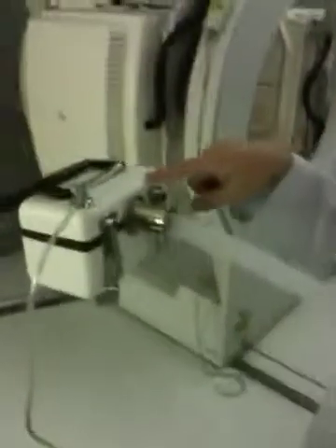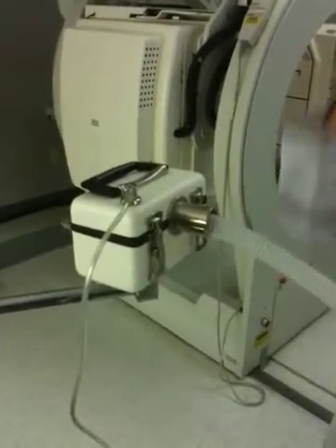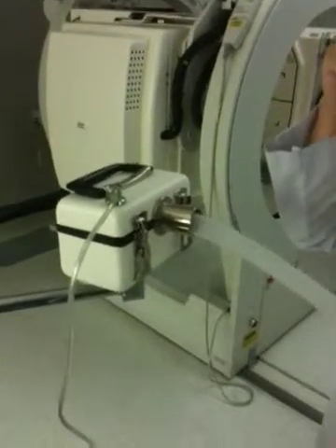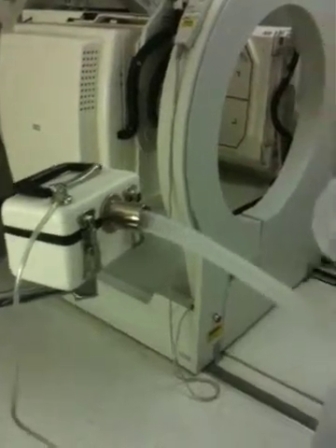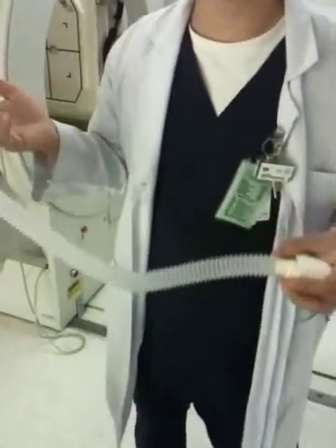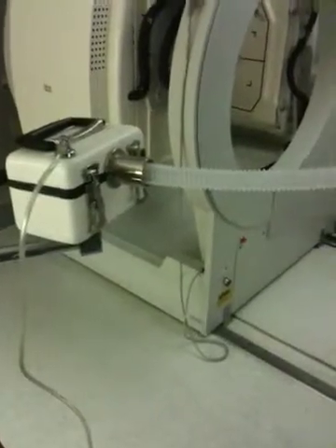The air is going to create a hissing sound. Now if you don't hear it well enough, add maybe one more mL of saline, because you want to have that vapor. Have the patient breathe in. They should breathe for 7 to 10 minutes — 10 minutes is better, but a minimum of 7 minutes. 7 should be enough. So after breathing in and out, coughing in and out, deep breath in, deep breath out — after 7 minutes, turn this off. That means no more vapor is being produced.